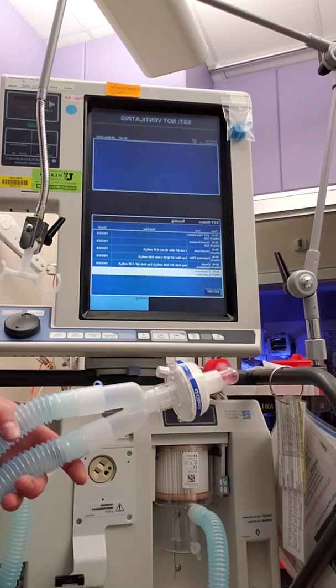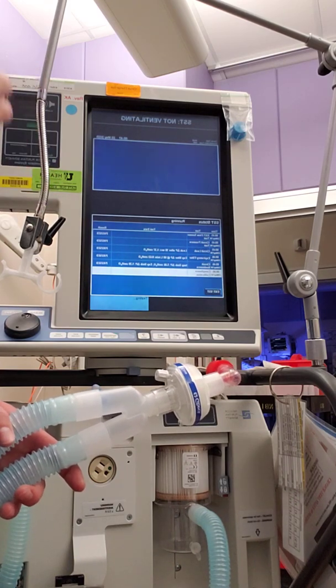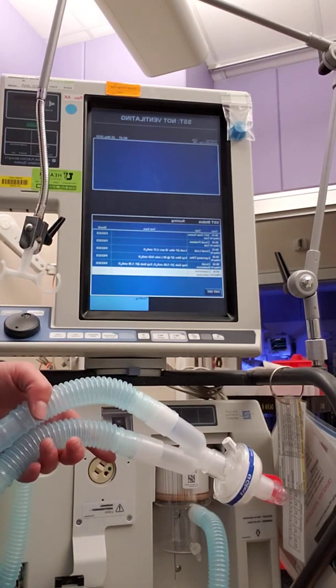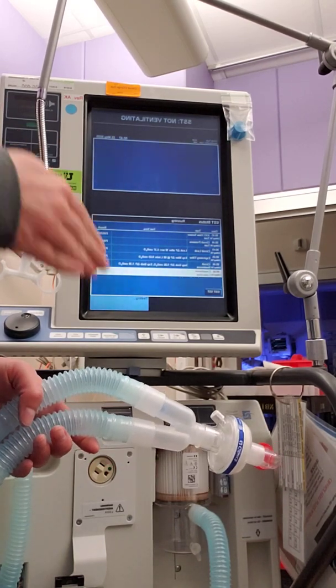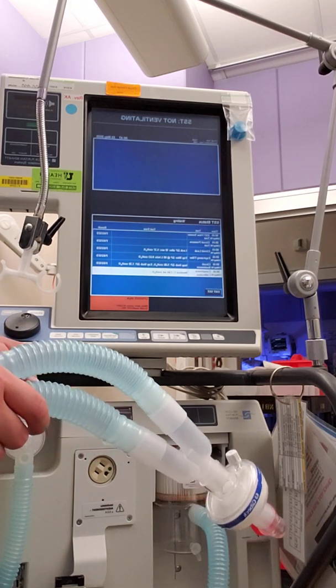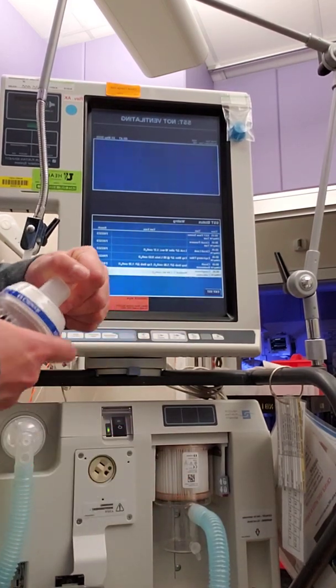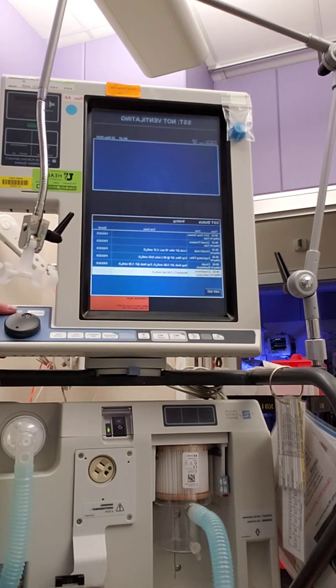So sometimes you'll hear loud pops. It's checking the resistance and the compliance of the tubing so that we are in a good, neutral, calibrated part for our ventilator. Okay, unblock Y is what this says. And then we press accept.